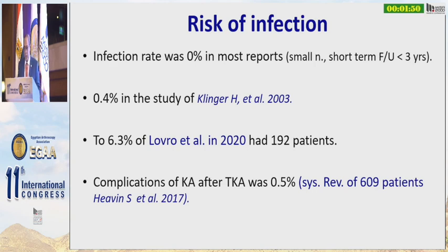Arthroscopy after arthroplasty is not totally risk-free. The most crucial is infection. Infection rate was 0% in most reports, 0.4% in the study of Killinger, to 6.3% of Lovro et al. Complication of knee arthroscopy after knee arthroplasty was 0.5%.